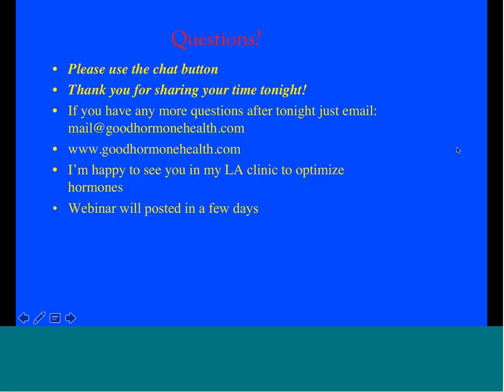Can the reader be used to check if someone is low and needs more hydrocortisone? Yes and no. If somebody has no adrenals, for example, you check this before you take the cortisol dosing, it's going to read zero, so it's not going to help you that much. You can test after, let's say an hour after, and let's say you normally go up to 2.6 or so after you take your hydrocortisone in the morning, and then one day you're under stress and it looks like you have a stomach ache, you're not absorbing things well. If it only goes up to 0.3, you can say you need to take more. So it can help you if your levels are low and you need more hydrocortisone. If somebody's on ketoconazole, and all of a sudden they start feeling low, they can check exactly in the morning.